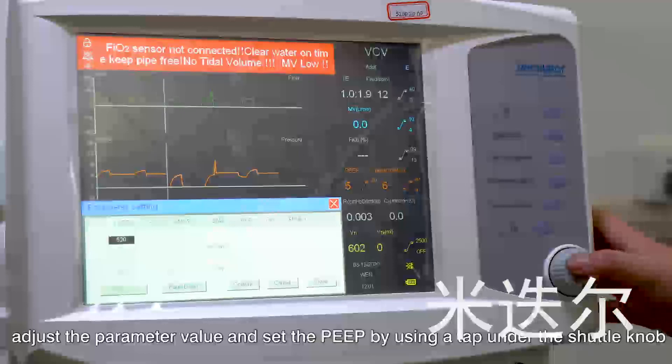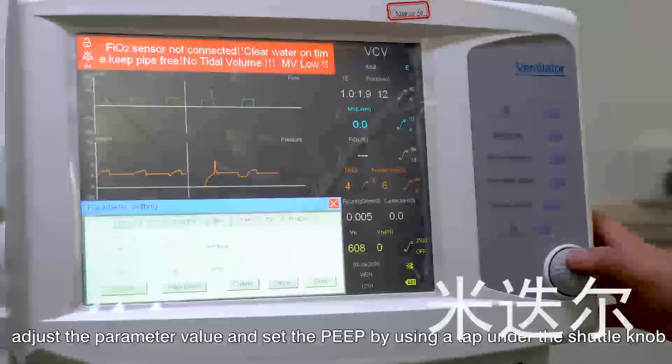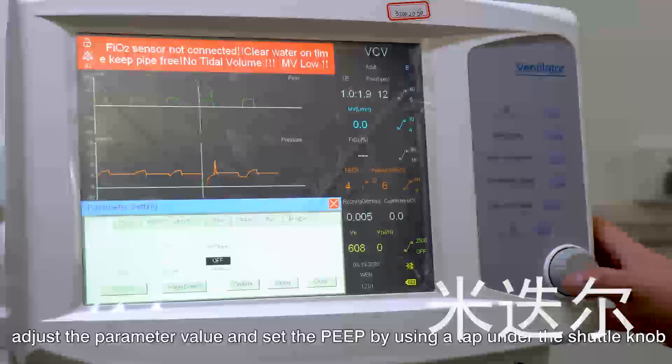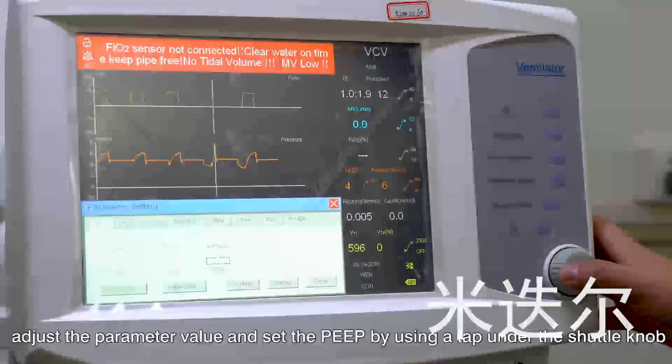Adjust the parameter value and set the PEEP by using a tap under the shuttle knob.